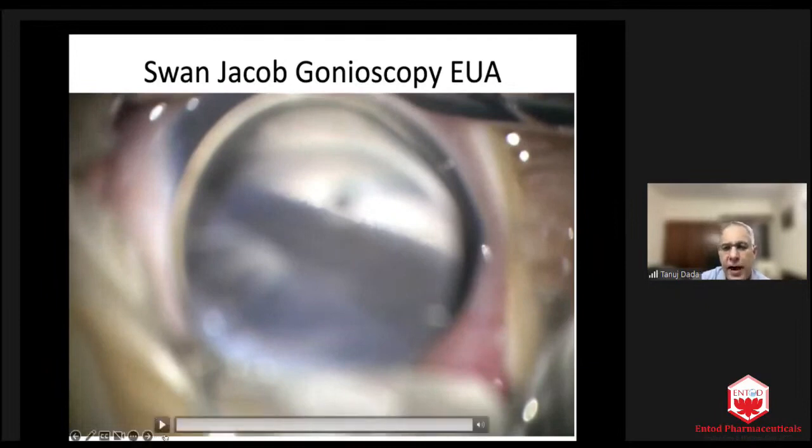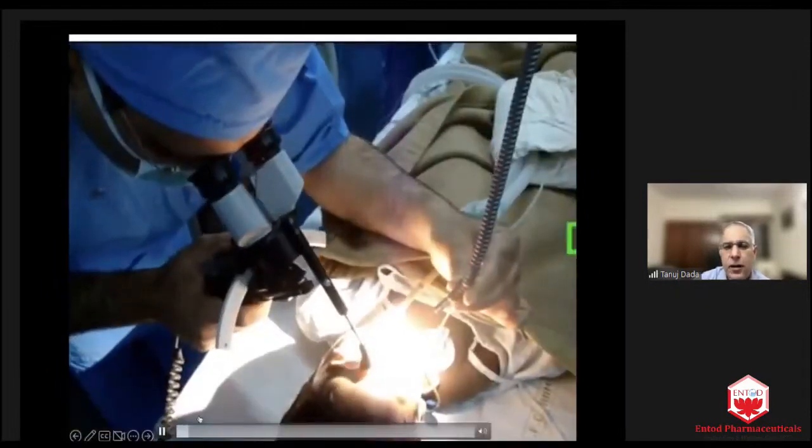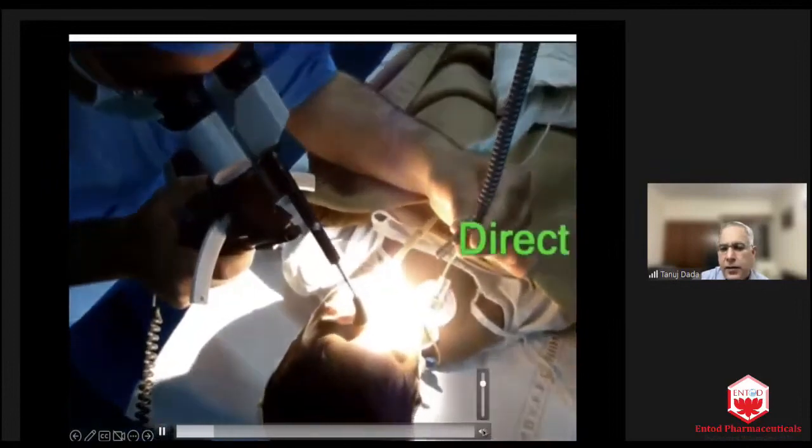So now you can view the angle structures under the microscope. This video depicts the technique of direct gonioscopy.